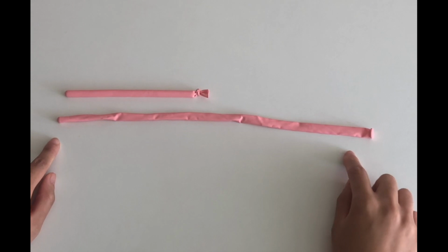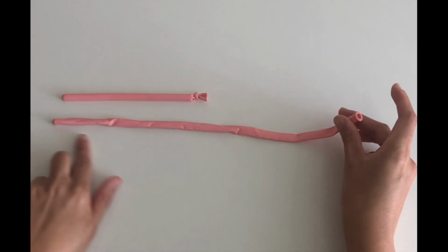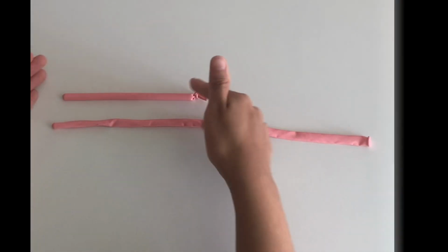Next, for the uterine arteries, you'll need 2 long pink balloons. Fill them with just enough water without expanding the balloon. Tie off the end at the midpoint, leaving around 7 inches. Cut off the excess balloon.